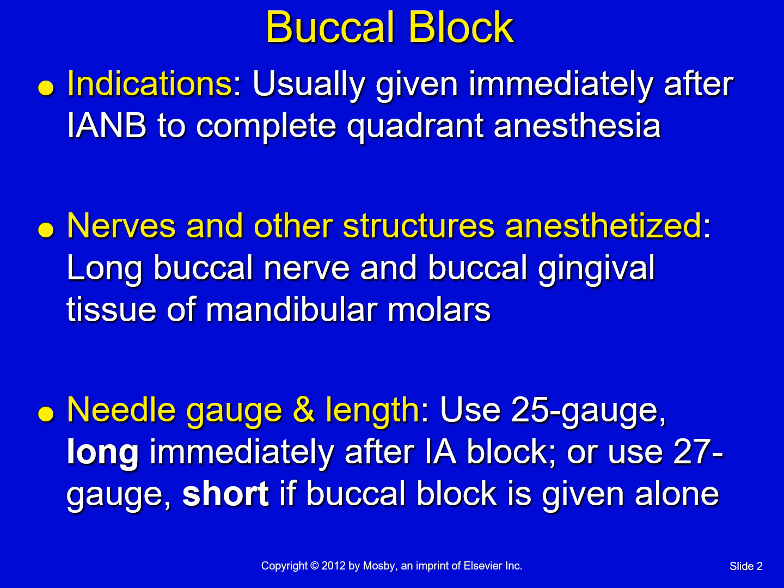So we don't stop and change needles. We'll just keep using that long syringe. But on this particular injection, you're only going in like 2 to 3 millimeters, maybe 4 at the very most, until you contact bone. You do contact bone on the IA, you contact bone on the buccal. But it's just not very deep on this.